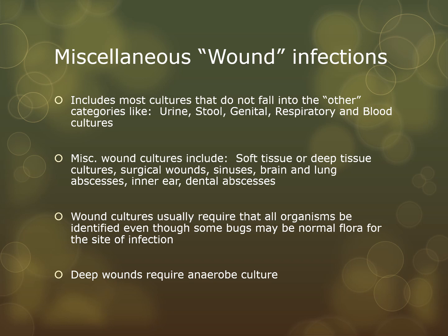Okay? So wound cultures usually require that all organisms be identified, even though some of these organisms may be normal flora. But we do want to line list these, okay? And remember, deep wounds require anaerobic culture.